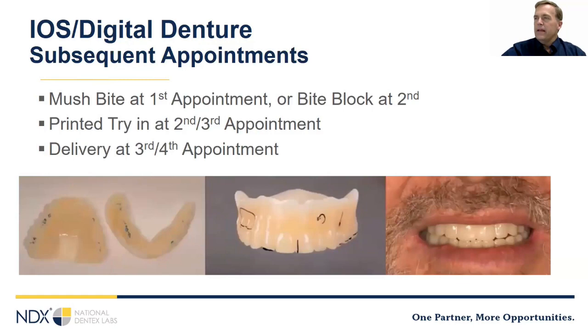Again, if you scan this, you'll either do a mush bite and scan it at the scan tissue appointment, or you'll do a bite block. Then from that point, the workflow will be the same as the analog digital workflow that we just talked about.